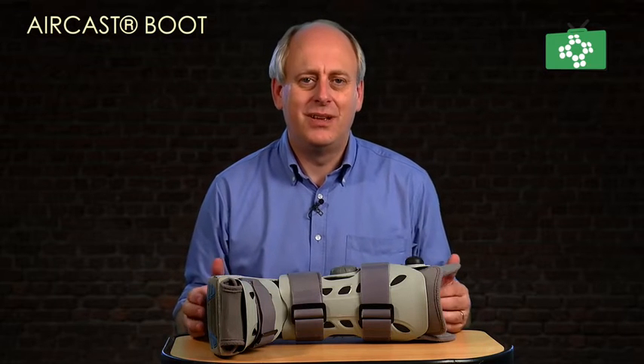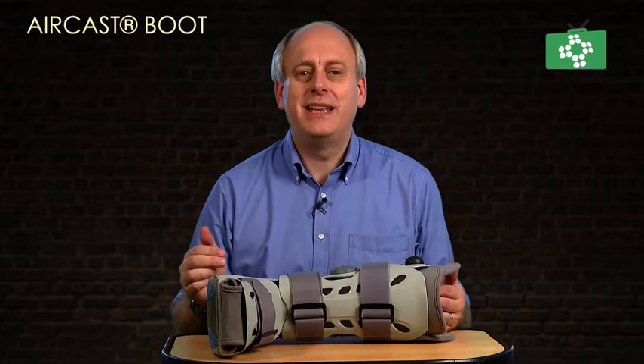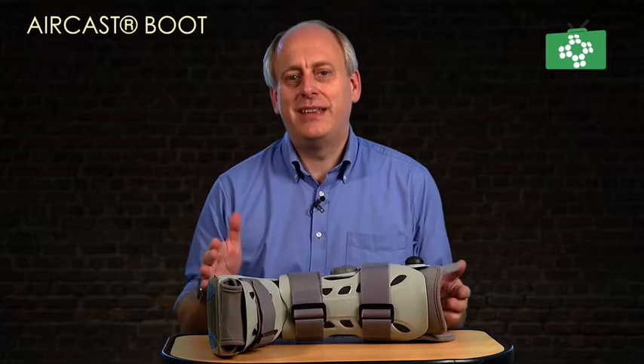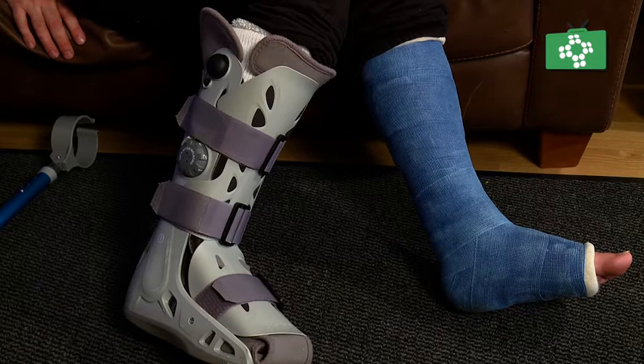Welcome to this edition of The First Aid Show. In the previous two videos, we looked at ankle arthroscopy and subtalar fusion, and in both of those we talked about the Aircast boot. So in this edition, what we're going to do is have a look at the Aircast boot, look at its features and benefits, and how to use it.